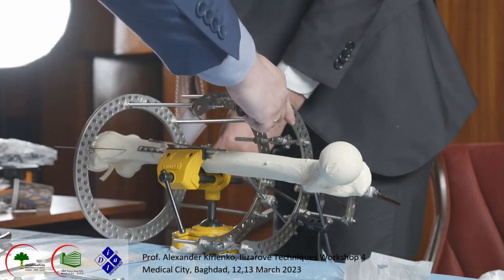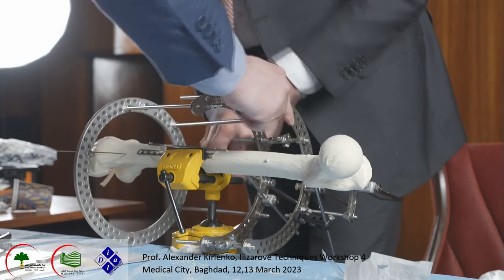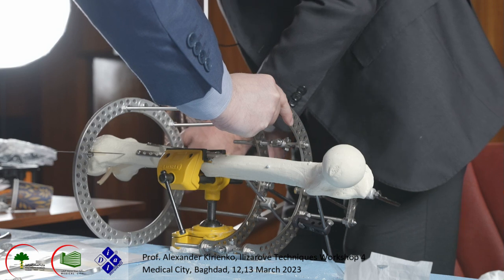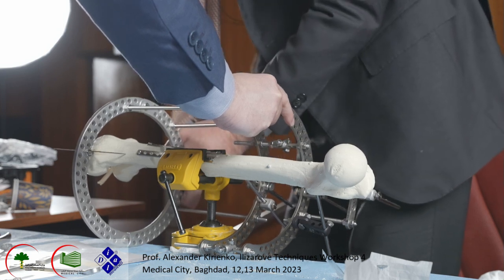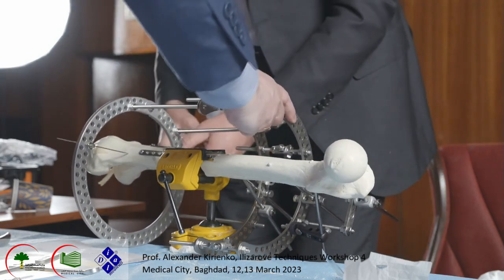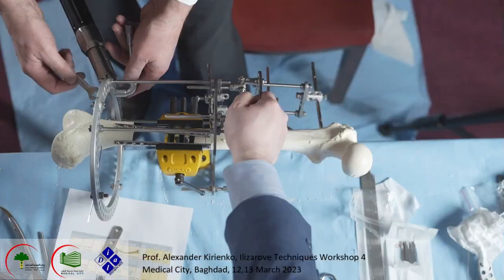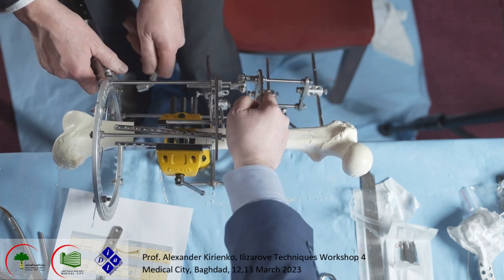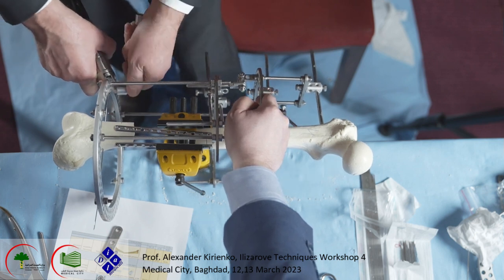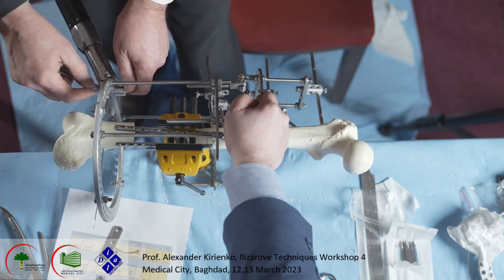Tension the wire. System. Okay, with tension in the classic way. In this way there is no displacement, nothing. Okay. Because this wire should be centered well, realigned well.